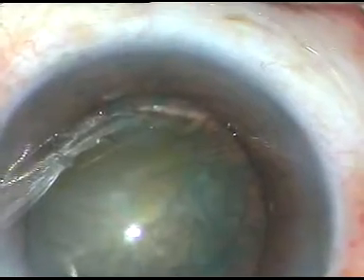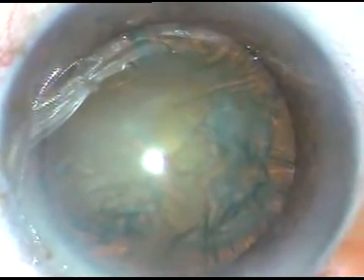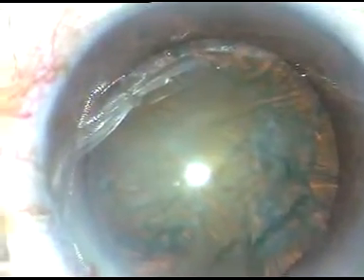Now is the time to manage the nucleus with ultrasonic emulsification. This is an Alcon phacoemulsification. The easy tip is marvelous — the hold is very good, and there is virtually no wound burn.